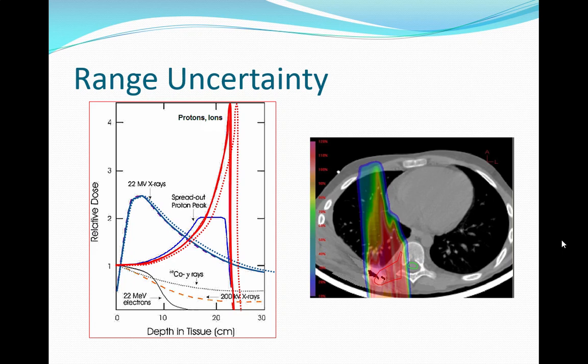All right, anybody got an idea what that is? Stomach. You? Heart. So, the diaphragm. Yeah.